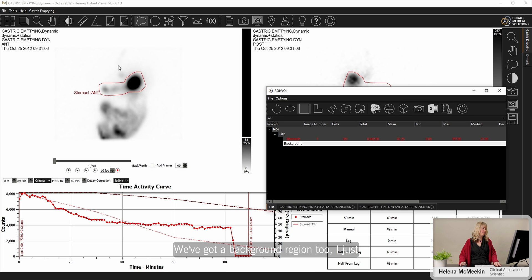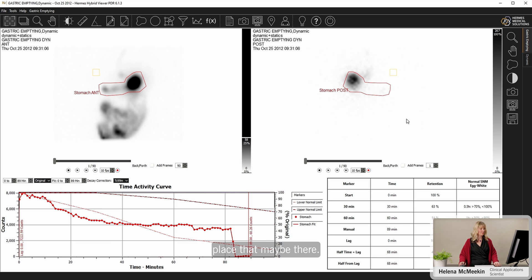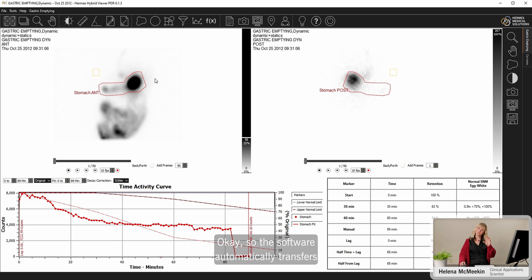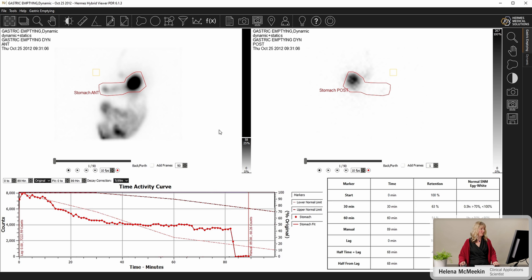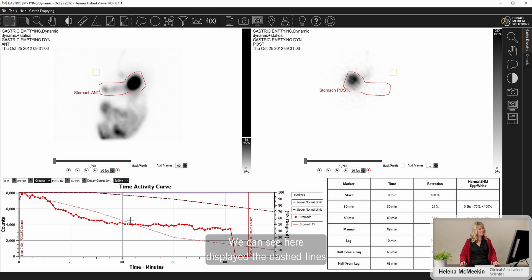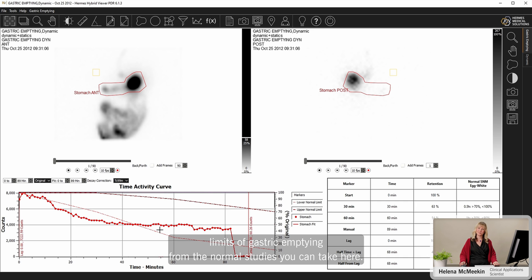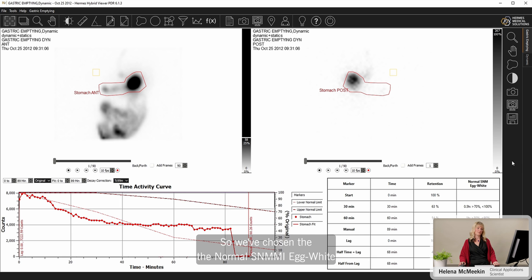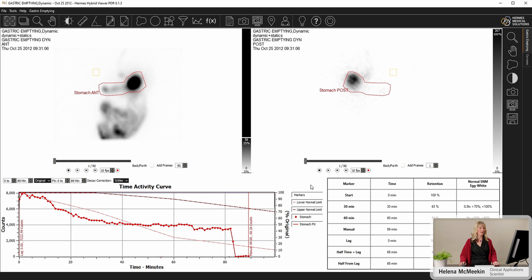I've got a background region too. I'll just place that maybe there. Okay, so the software automatically transfers that stomach region onto the post, mirrored to match. And then we can see the results display. So the solid red line is the gastric emptying from the patient. We can see here displayed these dashed lines. They are the normal limits. So the upper and lower limits of gastric emptying from the normal studies. You can take here, so we've chosen the normal SNMMI egg whites normal ranges, but you can enter your own normal range if you have a local meal that you prefer to use.